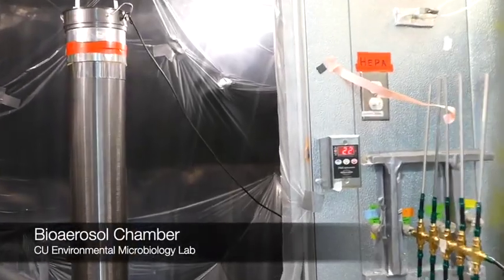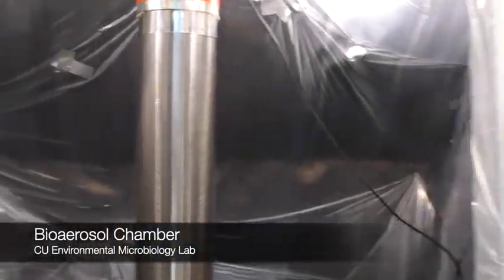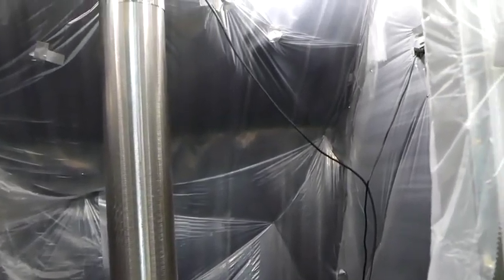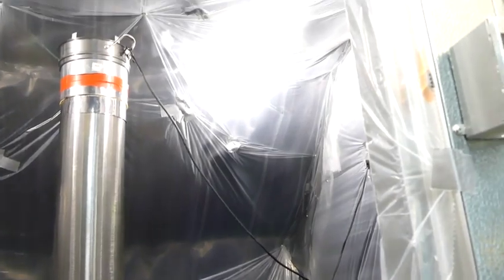We collect airborne microbes from literally all over the world. We essentially build a catalog of their colors as they age in an aerosol. And we aerosolize in the chamber under many different conditions. Low humidity, we can mimic the top of mountains in here, we can mimic ocean surfaces. We have those types of facilities.